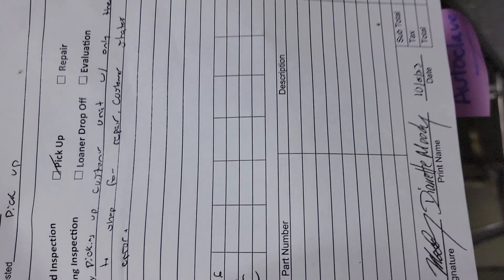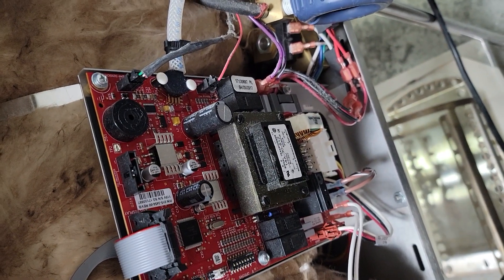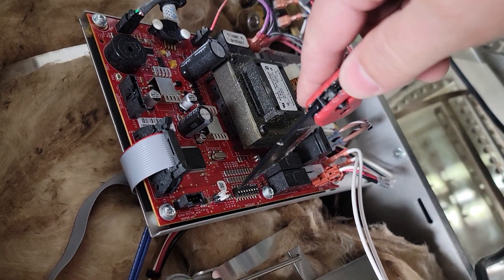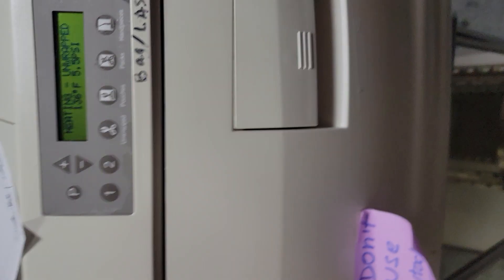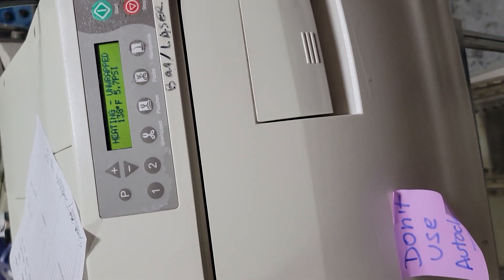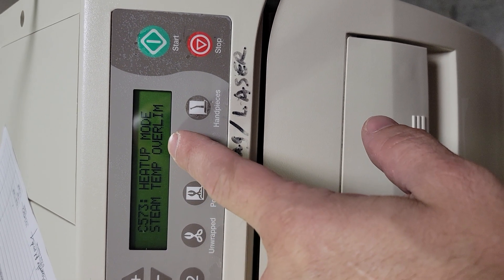The issue with this autoclave, as our work order says, is the customer states the unit has a steam error. When the cycle's over we can check it, but on newer Mid-Mark units there's no calibration — they've taken away those potentiometers, so the port either works or it's trash. To get into service mode, flip the first DIP switch, which puts you in service mode after a power cycle. And there's our error — heat-up mode, steam temp over limit, error C573.